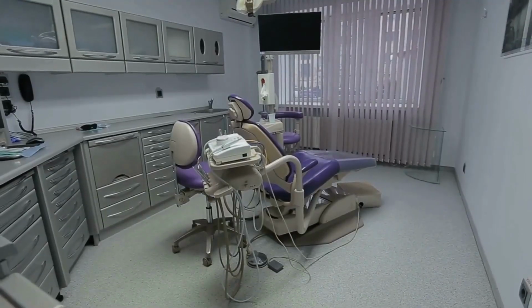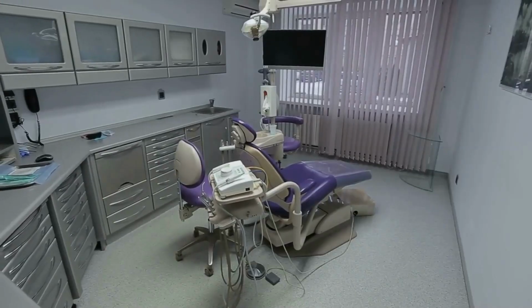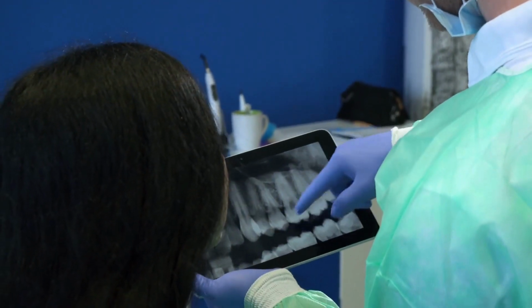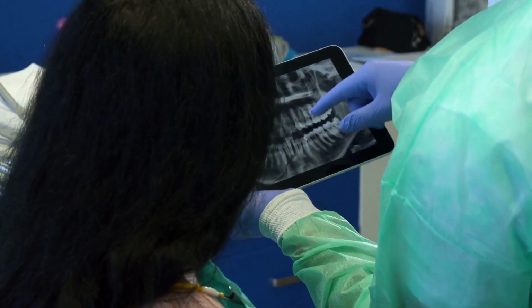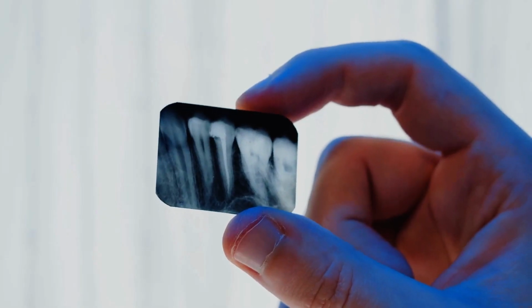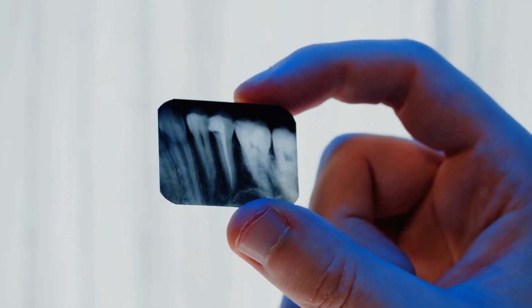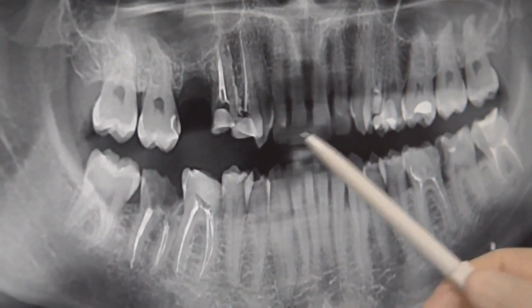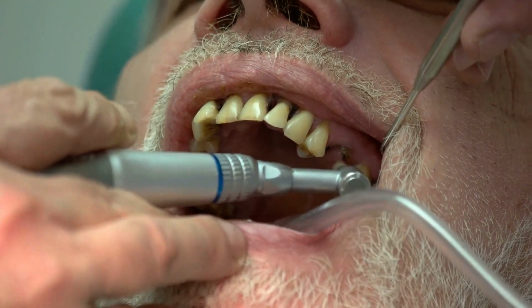The benefits of cross-polarized photography in dentistry are numerous and significant, impacting various aspects of dental practice. Firstly, the elimination of glare results in images that are significantly sharper and clearer, unveiling the intricate details of teeth and oral tissues with remarkable precision. This enhanced clarity not only elevates the aesthetic quality of the photographs, but also provides a wealth of information that might be missed under normal lighting conditions.